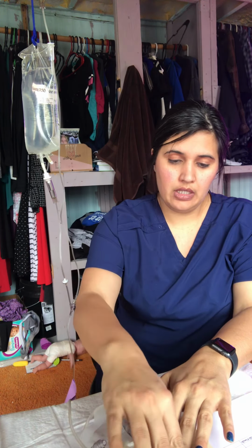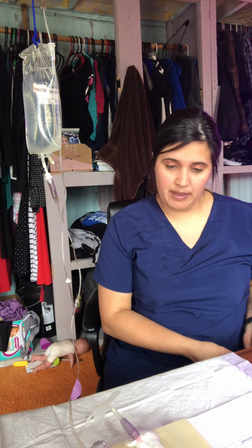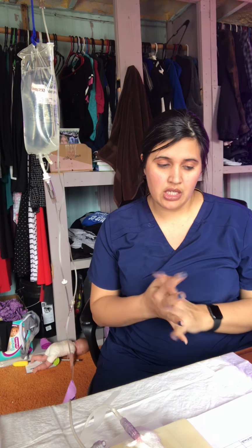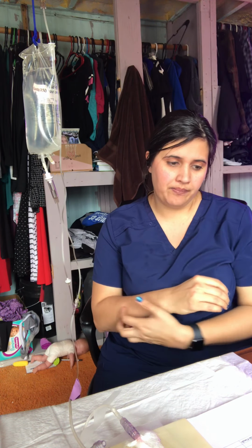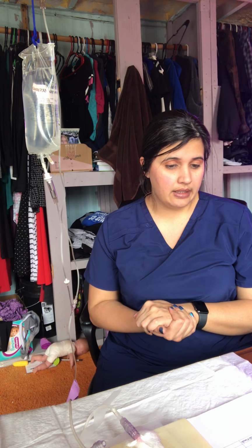I had come in and verified with the patient that this was the right medication and why she was getting it. And now I've put her in a comfortable position, made sure that she had her call light near her, and done my correct documentation.